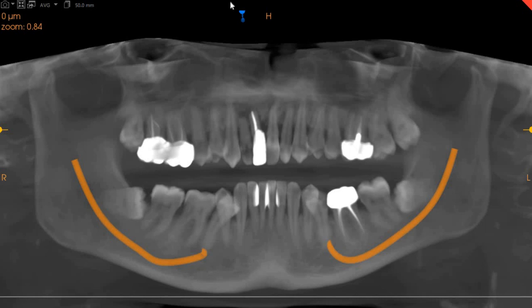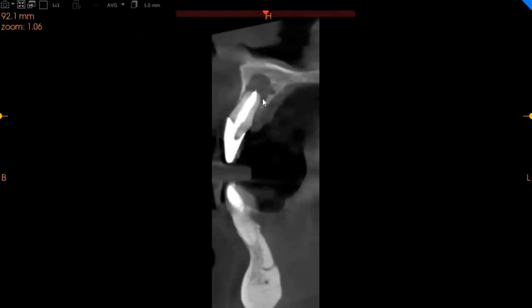Hello and Assalamualaikum. Ultrascan Diagnostics here. This is the CBCT of the patient that you had requested. The area of interest is the upper right central and lateral incisor. This is the trans-axial view.